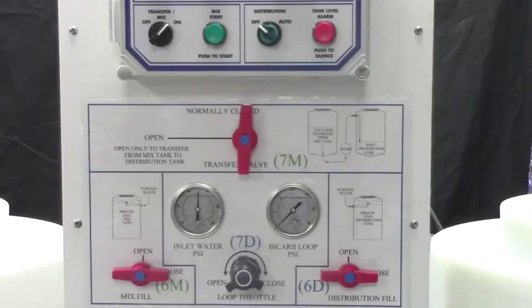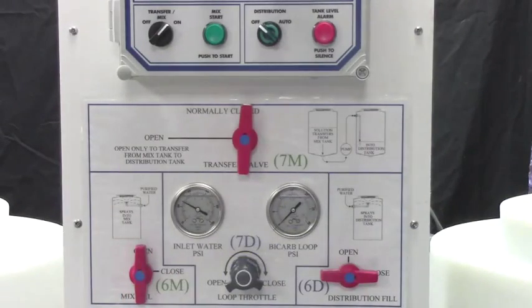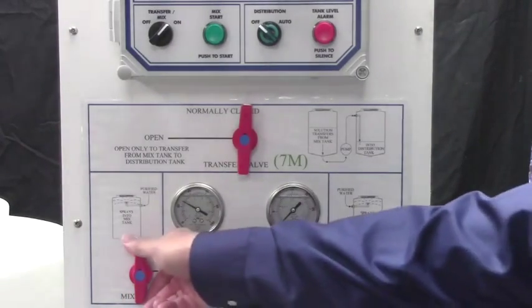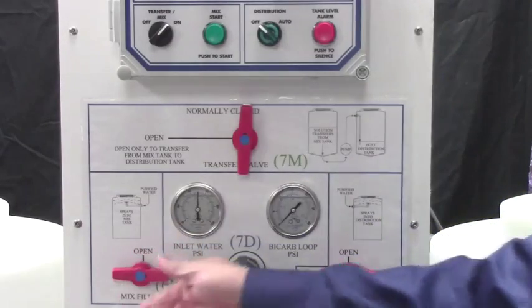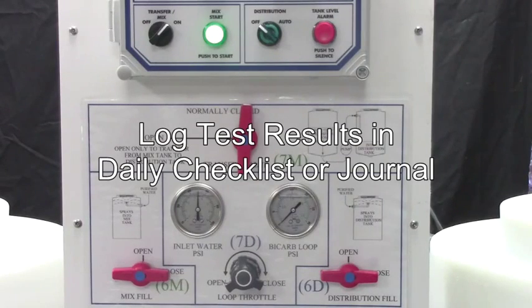If the solution concentration is too high, open valve 6M to add water as needed, then close 6M and push the mix start button to remix. Once the bicarb solution meets the manufacturer's recommended concentration level, log the test results in your facility's daily checklist or journal.